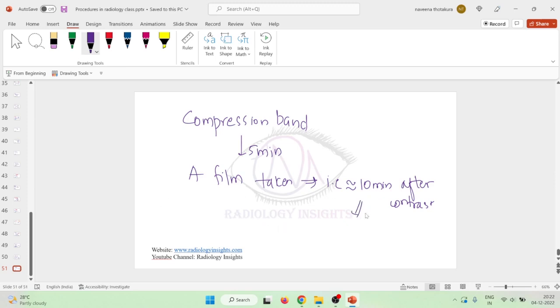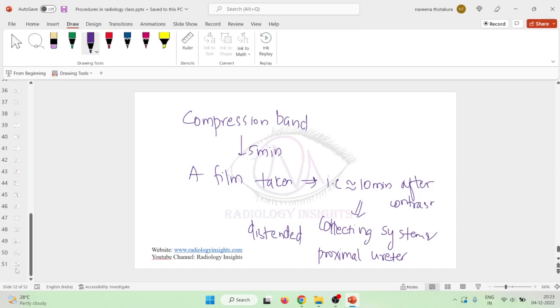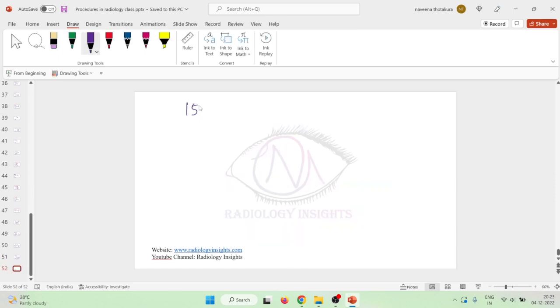In this 10 minutes film, you can see the collecting system which is distended, and also the proximal ureter which is distended can be seen clearly. Then followed by this, we have a 15 minutes film.